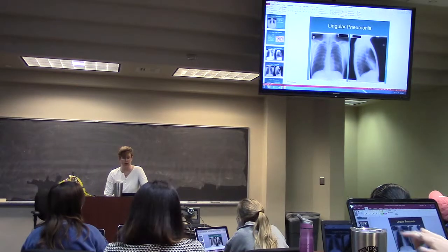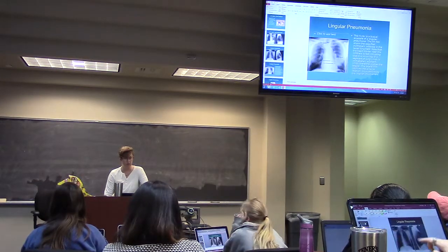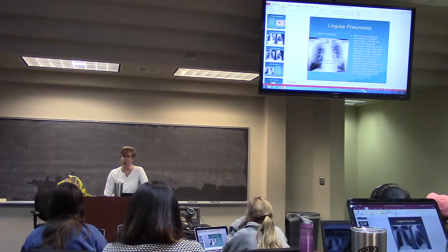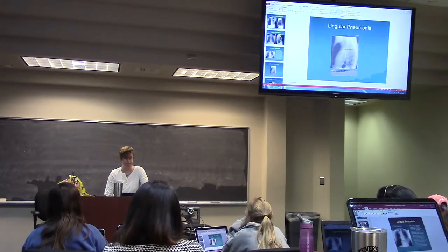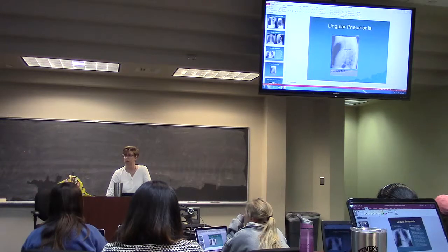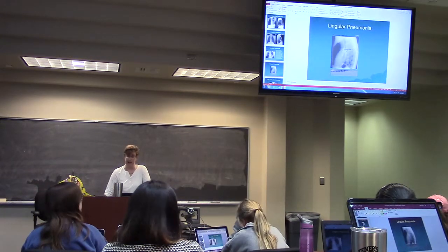That's nice and dark here. It's definitely dark here. Looks good. Definitely loss of my margin here. Okay, and then you see this darkness, this density or opacity.